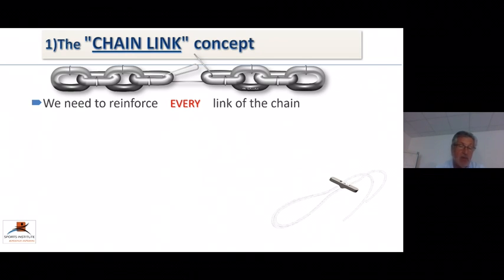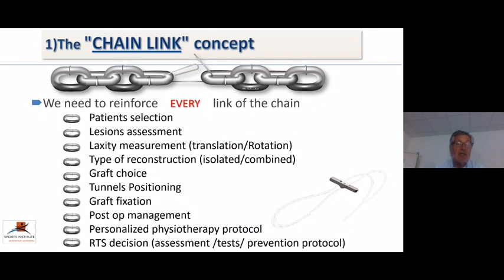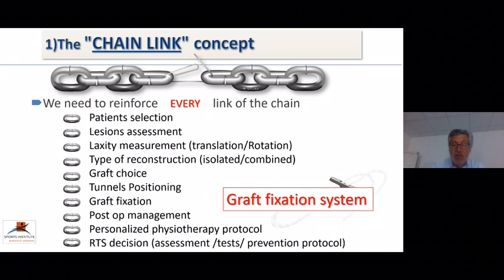And we have so many links. It's not a limited list, but patient selection is one of the links. Lesion assessment is another one. Laxity measurement, such as the translation and rotation. The type of reconstruction, isolated or combined with additional lateral reconstruction, depending on different parameters. The tunnel positioning, the graft fixation, the post-op management, personalization of the physiotherapy protocol, but also the return to sport decision. In this topic, we only consider one of the links, which is the graft fixation system, but don't forget the other ones, please.